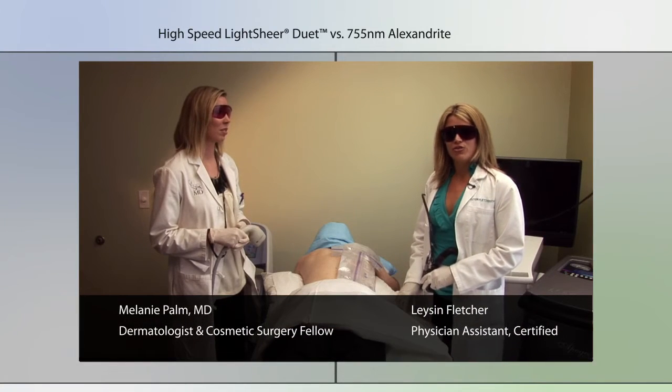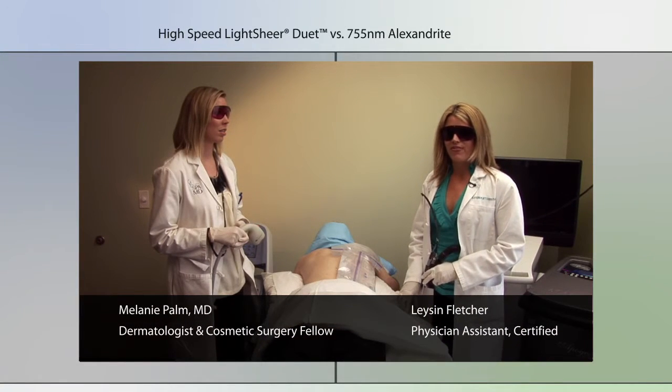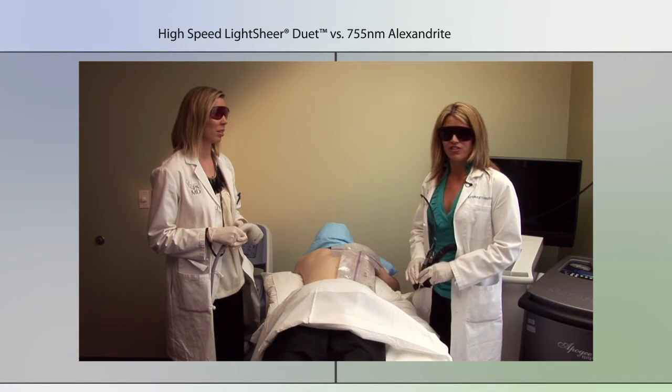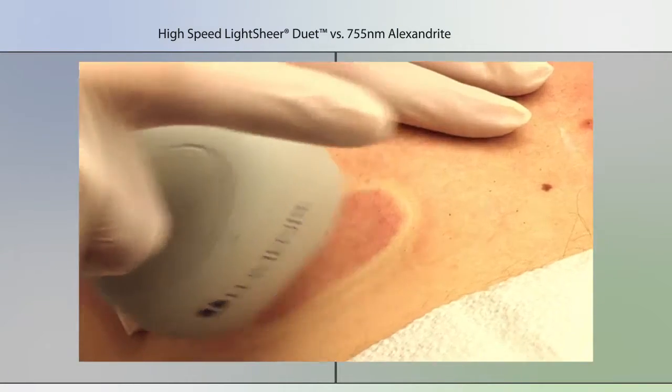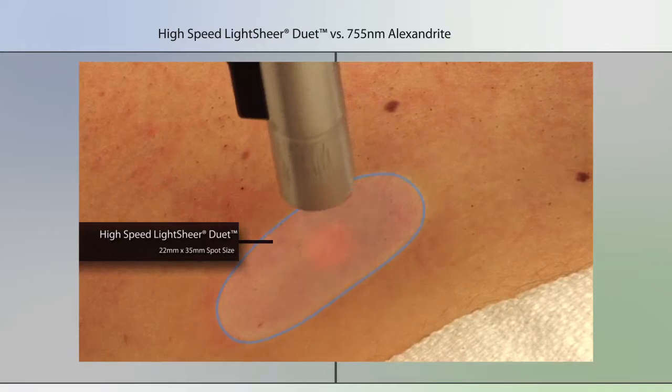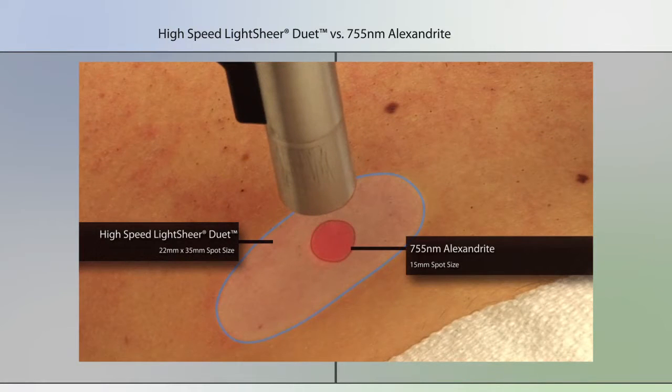Going to do is we're going to be treating half of the back with the 755 nanometer wavelength of light and the other half of the back with the LightSheer Duet. You can see an imprint right here of the treatment area. Just as an overlap, we're not actually going to fire the laser, but just so you get a sense, this was the treatment area previously, so you get a sense of the spot treatment from a comparable laser device used for a similar patient.